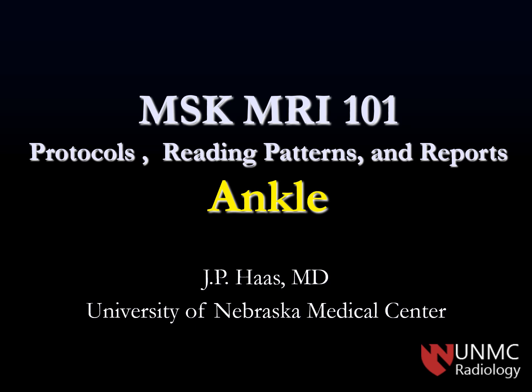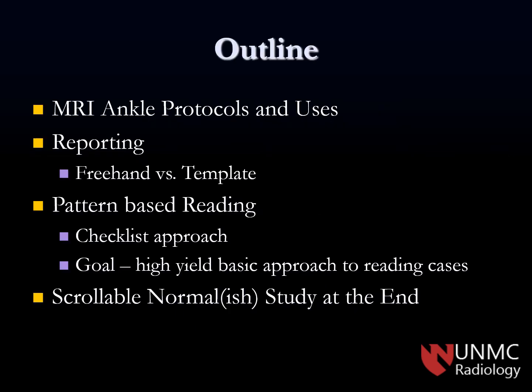And the goal of this is to be a fairly quick run through of ankle MRI to get a starting point and a strategy for reading these when you first get to the bone room and to be more comfortable with that. So with that, we'll just go forward.